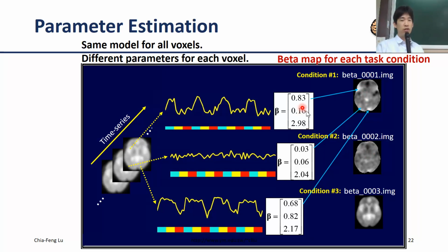Again, you can do very similar things: I can extract all the beta 2 values from each pixel and map them to the corresponding location right here. Then you have the beta 2 map. And you can see the beta 2 map doesn't have a so-called hotspot, or high beta 2 value. That means none of the brain regions or voxels are correlated to condition 2.